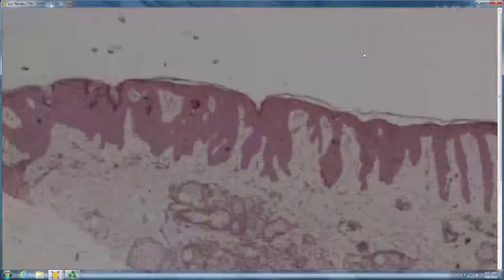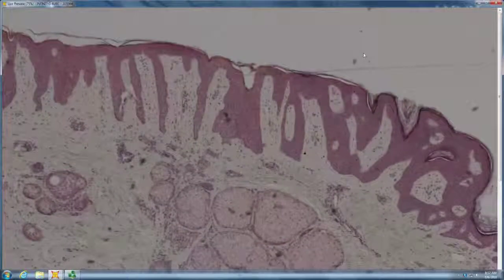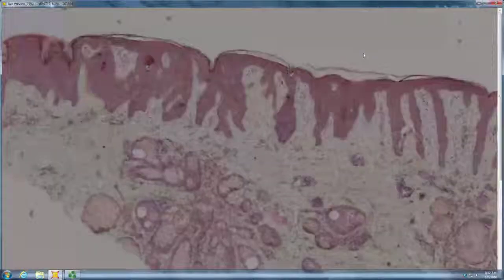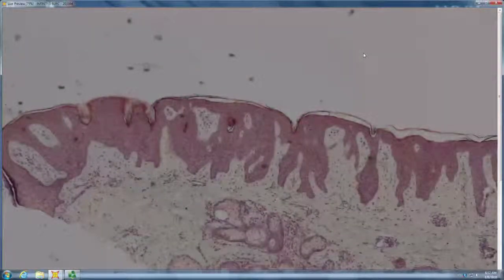See sebaceous ducts down below. It looks broad. Do you see any terminal hairs? I do not. It probably was bald. Yeah, that's a nevus sebaceous. It's probably a piece of the nevus sebaceous. And then what happens with nevus sebaceous? Anything grow in them? Yes.